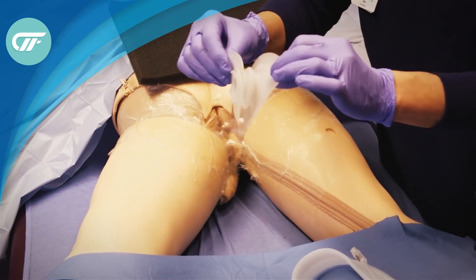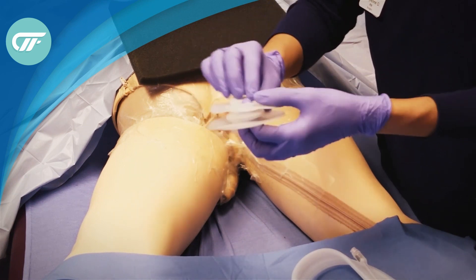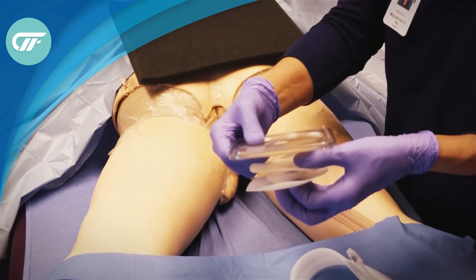The negative pressure foam goes between the two flanges, and the fecal management system goes through here. Then a hydrocolloid ring will help to get the seal.